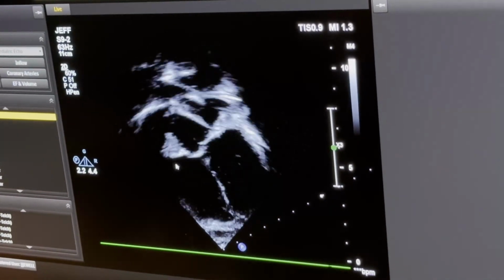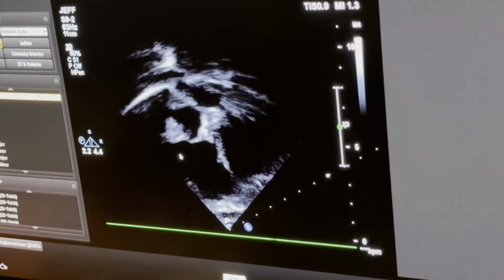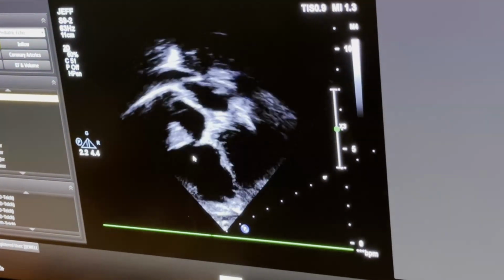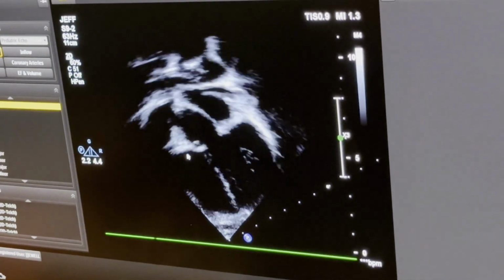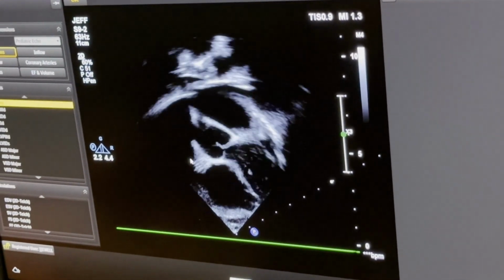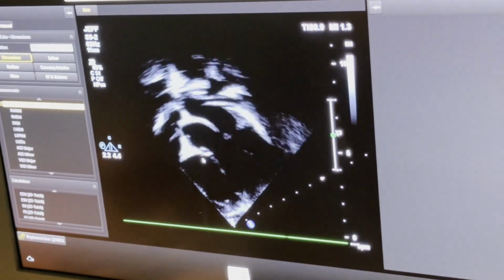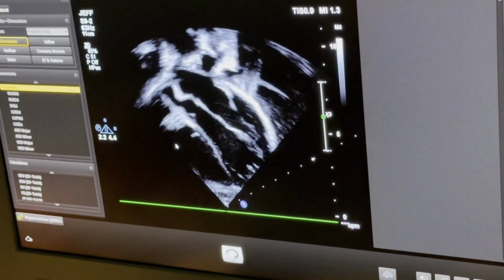So whenever I'm looking at these coronaries, I really want the internal portion, just like I do here, to be nice and black. And the external portion, like right in here, I want to be nice and white, nice shades of gray through there, because that just accents where that is just a little bit more. So you can see all of that coming in there.